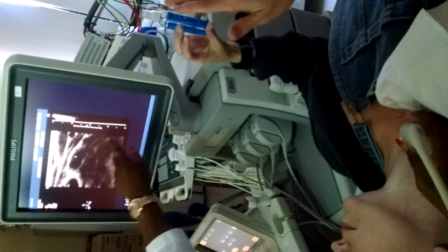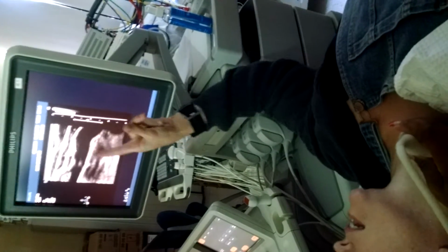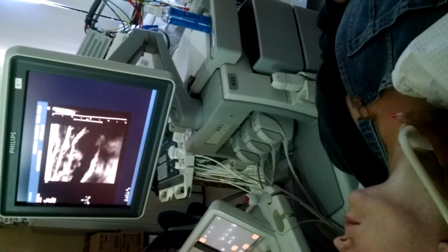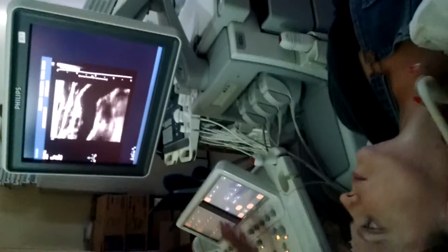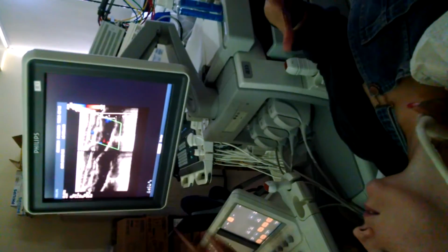Right. Because see, here's the innominate. Here's a little bit of subclavian. And this is common. Right. Okay. Once that's come off, then it's subclavian. Yes. Okay, I understand. But now I don't see that. It's just an artifact, like a reverb, like a mirror image of what you would see. We probably could use a higher frequency on her if we had it. The common's back here somewhere. The common is up here.